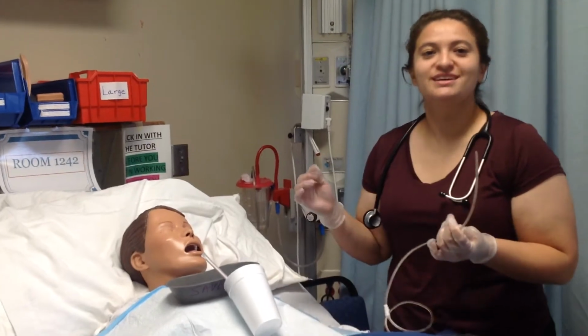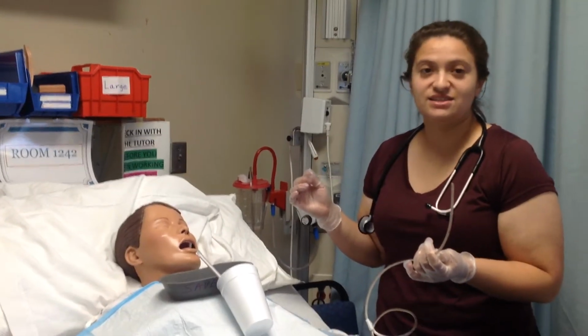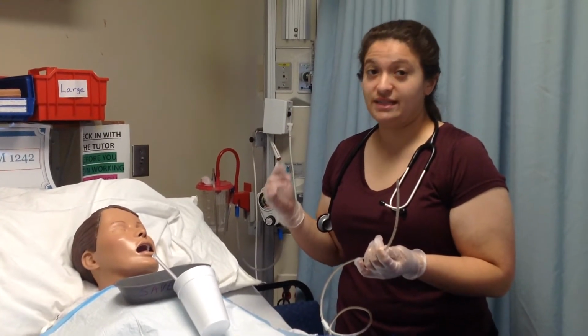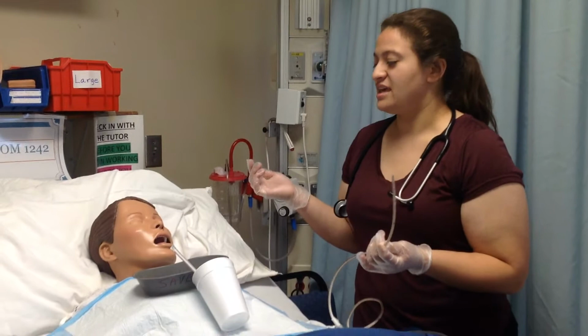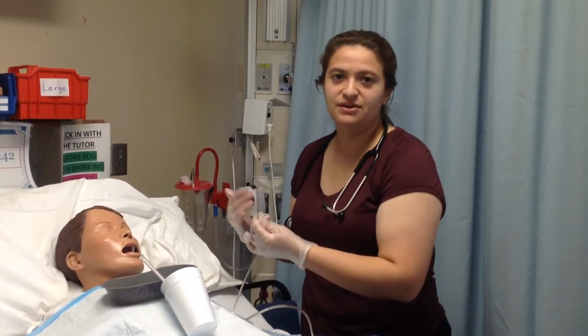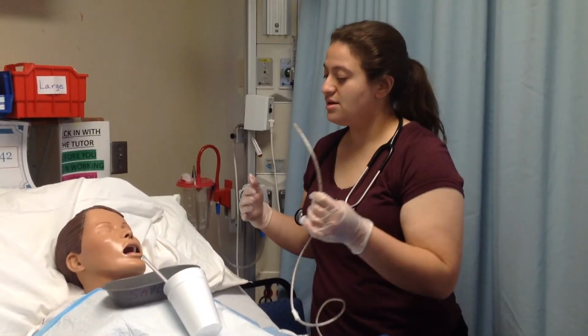First things first, I would want to make sure to ask the patient to touch each nare and ask which nare it's easier for him to breathe out of. So let's just say he would say it's the right or the left. So I'm on the left side, and I would go ahead and do it on the left side. And I would also document that as well.